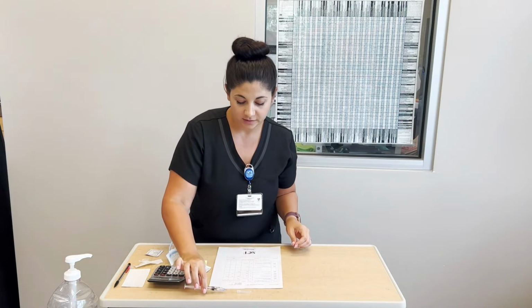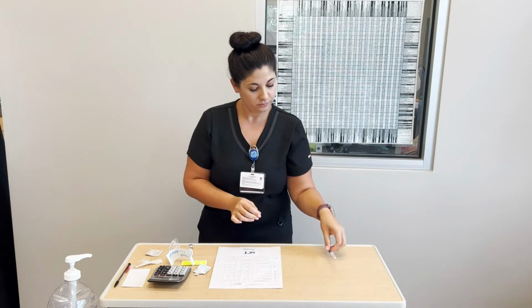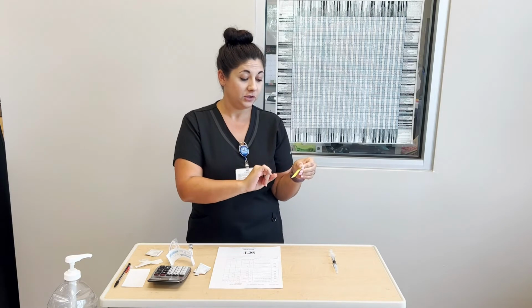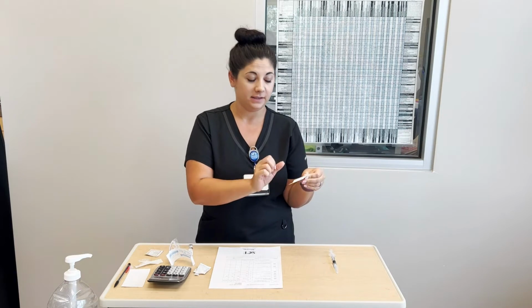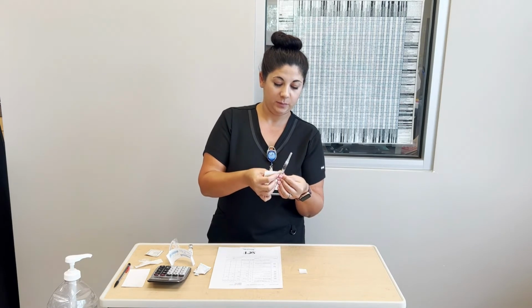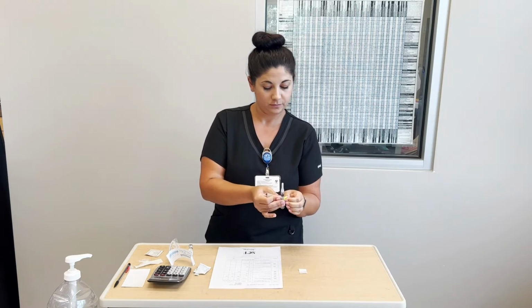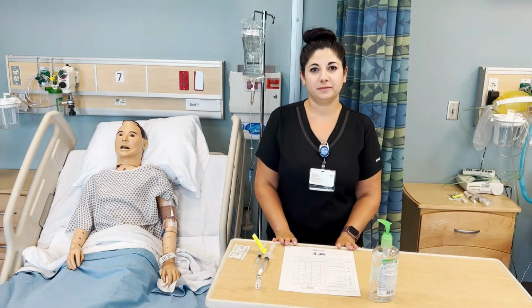Carefully using a one-handed scoop, I will recap my needle. And then label it with the patient's initials, the drug name, the dose in milligrams, and the date and time. Making sure to keep the numbers visible on here. And I'm ready to go to my patient's room.